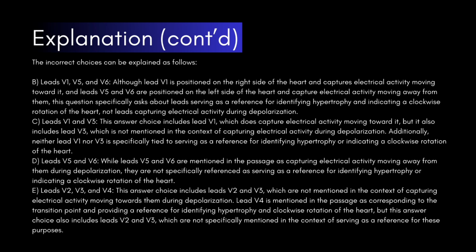Lead V5 and V6. While leads V5 and V6 are mentioned in the passage as capturing electrical activity moving away from them during depolarization, they are not specifically referenced as serving as a reference for identifying hypertrophy or indicating a clockwise rotation of the heart.